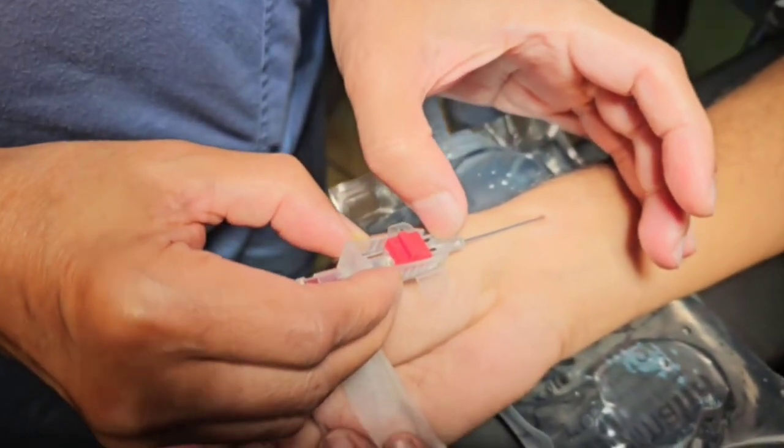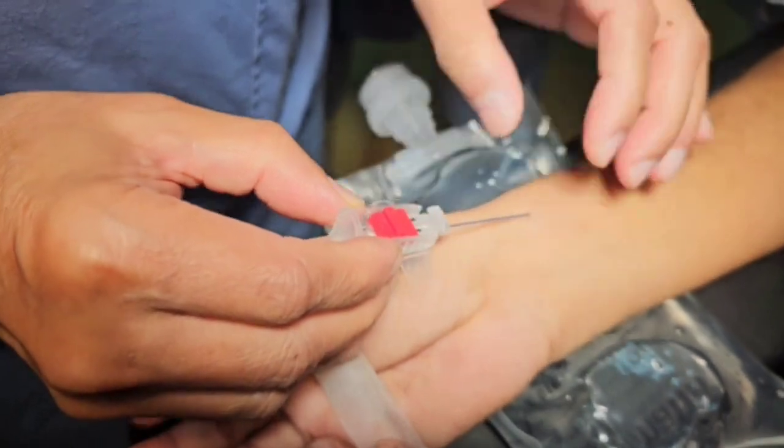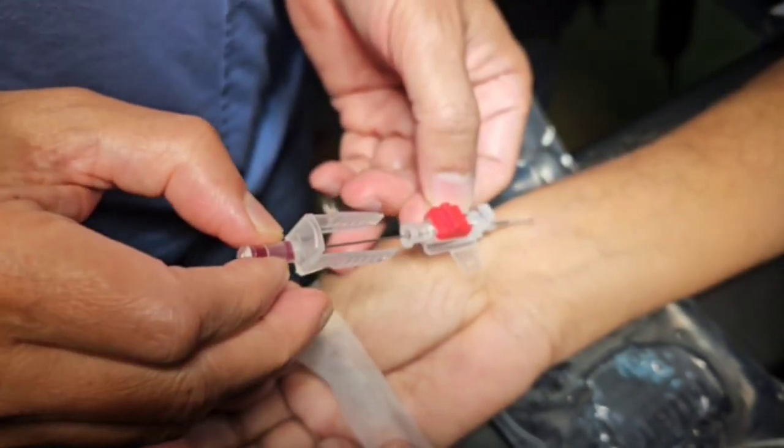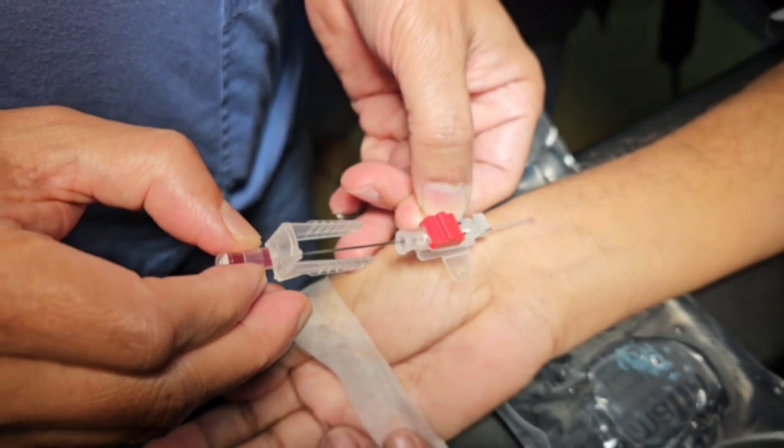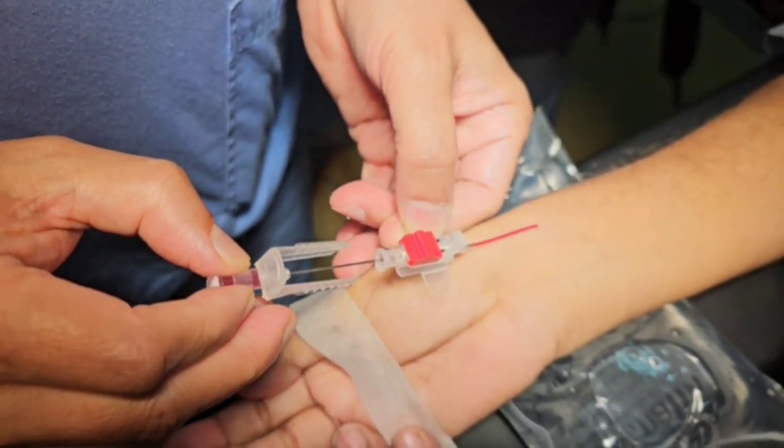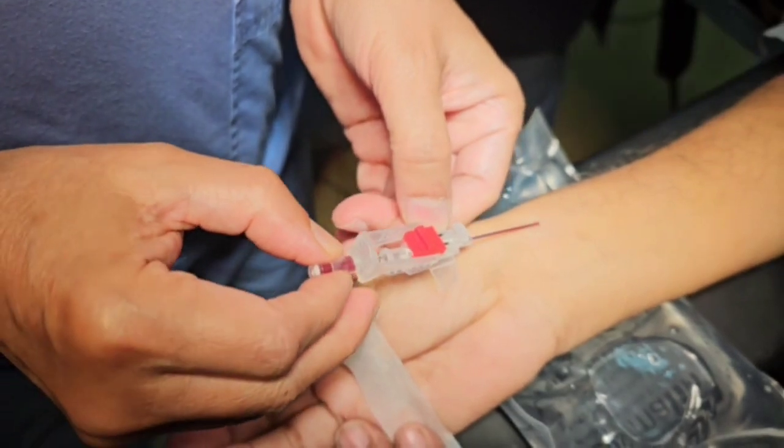If the catheter cannot be advanced over the needle, then we have to shift to the through-and-through technique where we advance the needle further 1 to 2 millimeters, then remove the needle slightly backward from the catheter and look for pulsatile blood flow as the catheter is pulled backward.